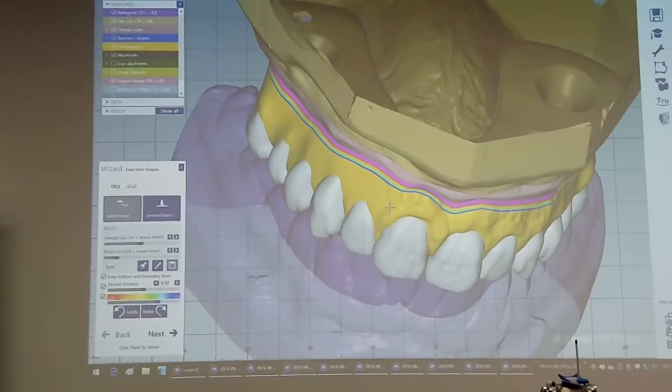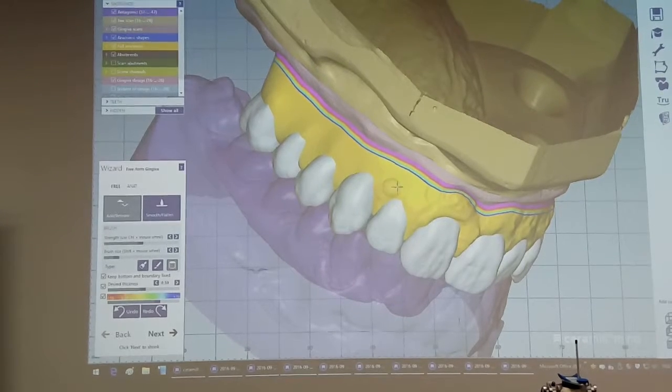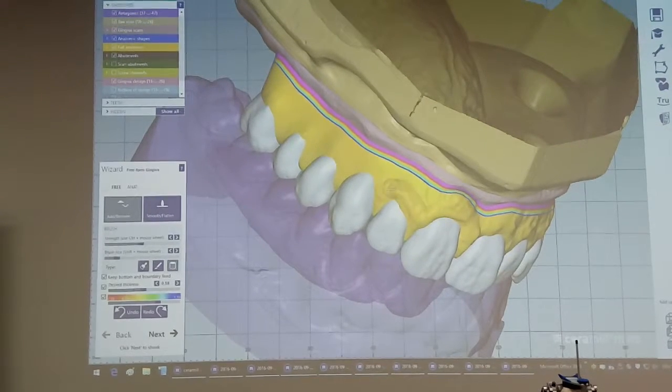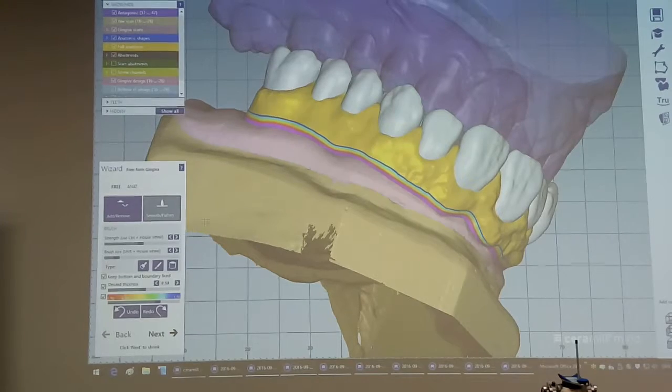Such tools are more or less tools for adults when they want to play. You can do this. If my dentist would like to have a soft, smooth surface, I don't want to do this. But in general, it's up to the individual surface what we want to have as a final result.